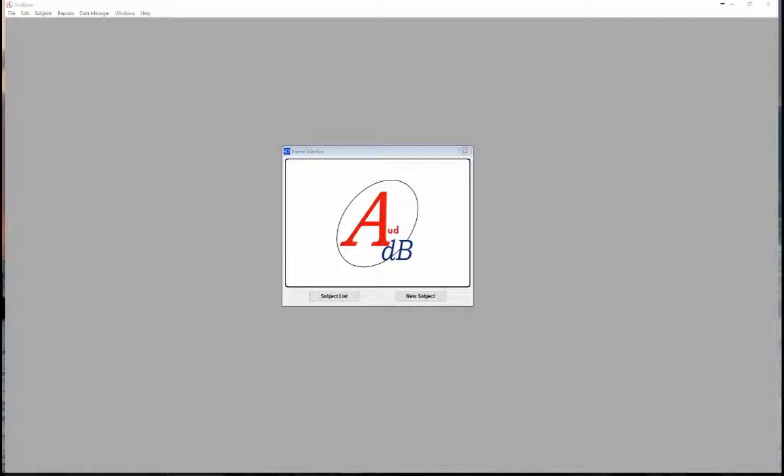We also have the availability of customized interfaces with multiple EMR solutions. This greatly improves workflow, saving time and money. AudBase also offers dedicated support through AudSoft Inc. At AudSoft Inc., this is all that we do.